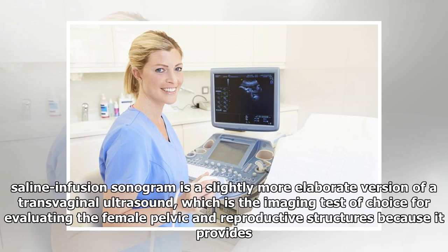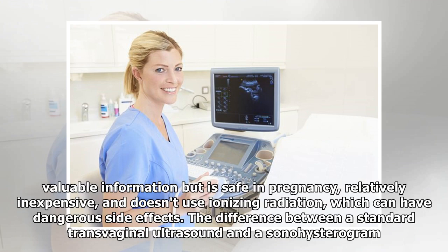A saline infusion sonogram is a slightly more elaborate version of a transvaginal ultrasound, which is the imaging test of choice for evaluating the female pelvic and reproductive structures because it provides valuable information but is safe in pregnancy, relatively inexpensive, and doesn't use ionizing radiation, which can have dangerous side effects.